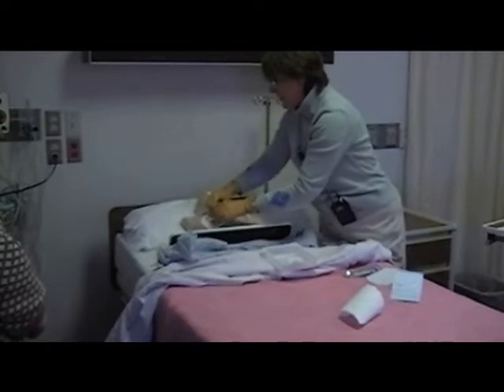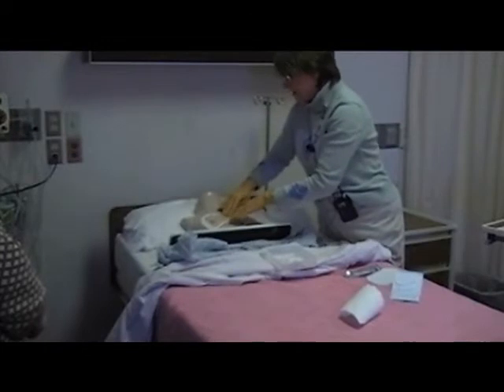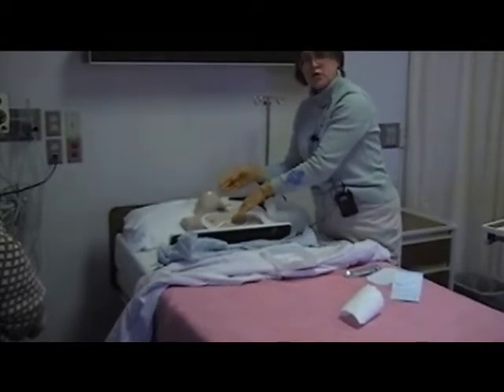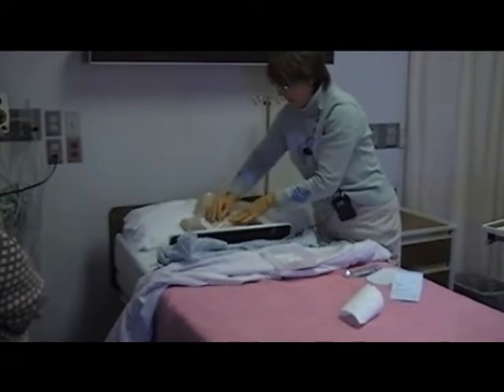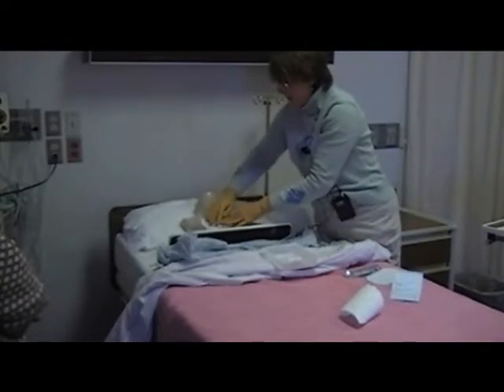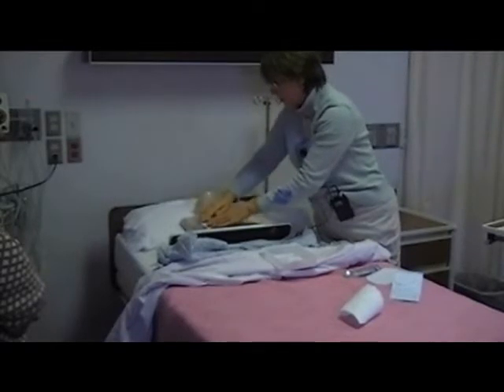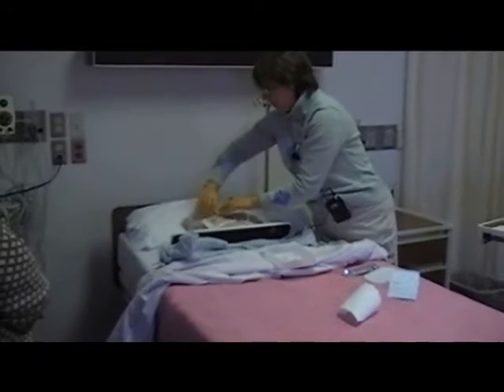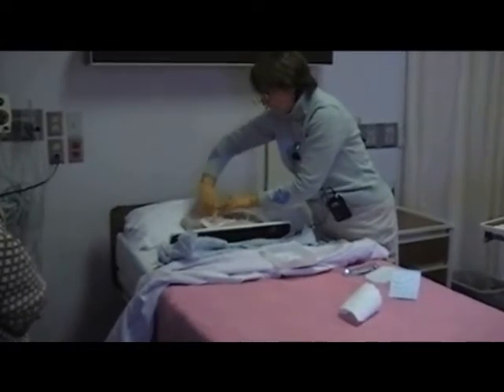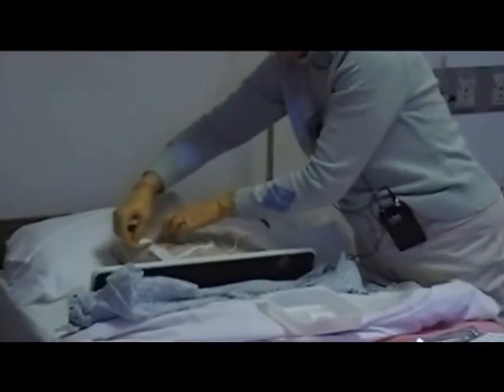And I allowed that to dry for anywhere between 30 seconds to 2 minutes, depending on what policy says. And you can definitely see where the skin appears dry. It will no longer be shiny. Okay? So I'm going to seal that down good. And on a real person, it dries quite rapidly. Okay, after that is down, I'm going to remove this outer window pane.